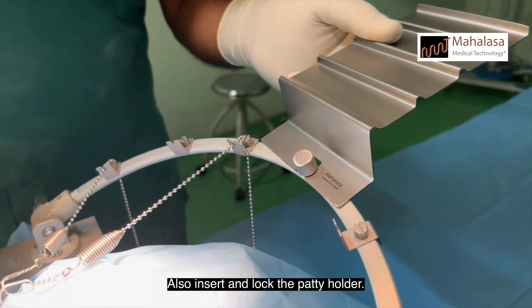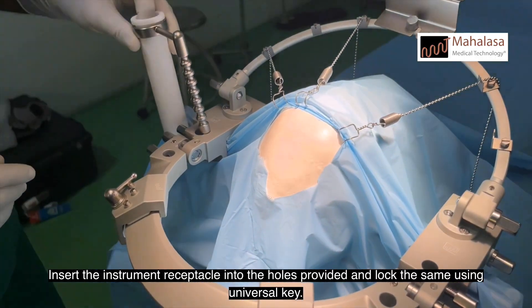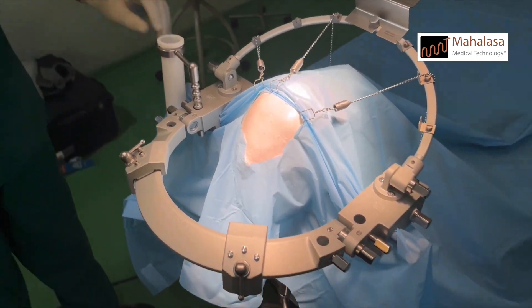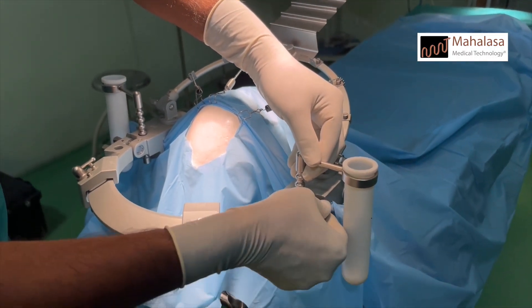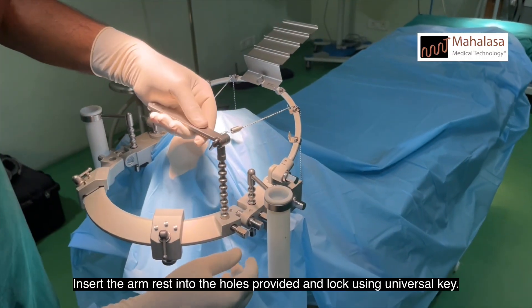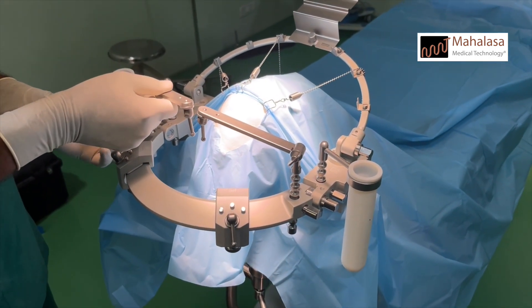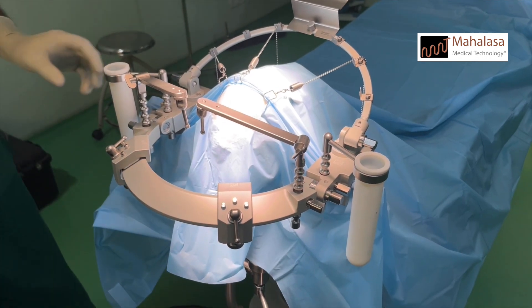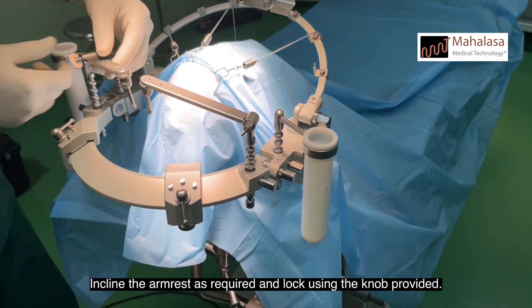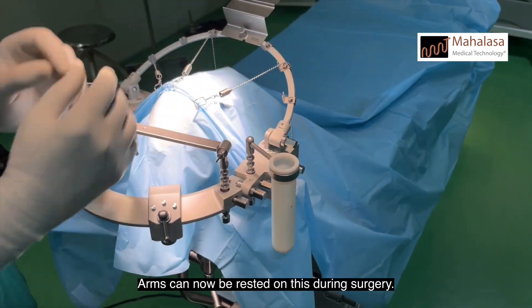Also insert and lock the patty holder. Insert the instrument receptacle into the holes provided and lock using the universal key. Insert the armrest into the holes provided and lock using the universal key. Incline the armrest as required and lock using the knob provided. Arms can now be rested on this during surgery.